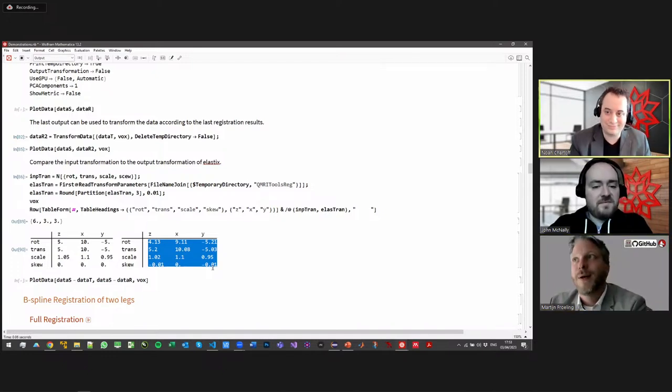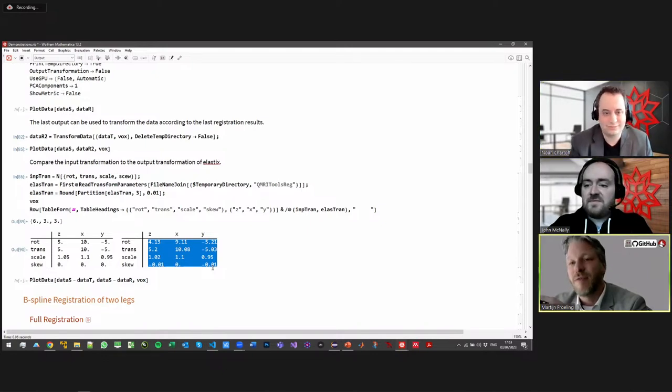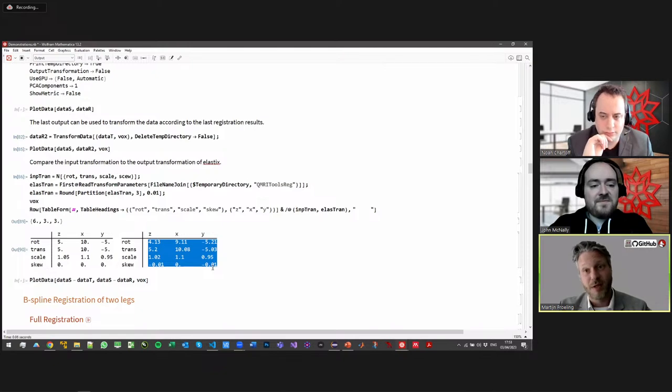When we do data, evolving over the years, by now I have this one script that I can run on my data set that I acquire. I go to the scanner, acquire some data, put it in a specific folder on the server. I turn on my notebook, run the scripts, and then I wait a few hours and everything's processed. That's all done in Mathematica. That's a really high level of automation.